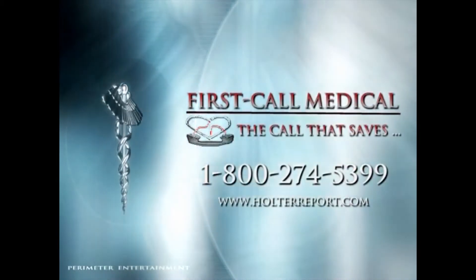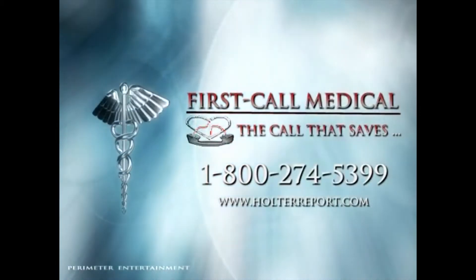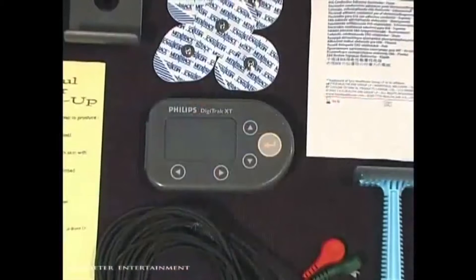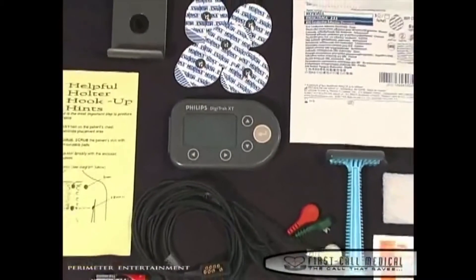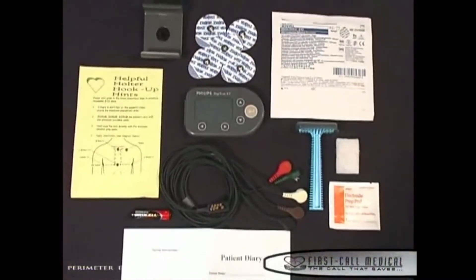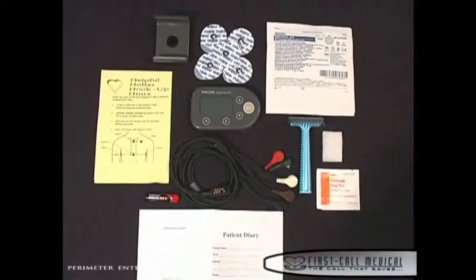The following is a demonstration for the proper application of a Digitrack XT holter monitor. Your Digitrack XT holter monitor was delivered to you in a case with a set of lead wires. You also received a plastic bag that contains your holter kit.